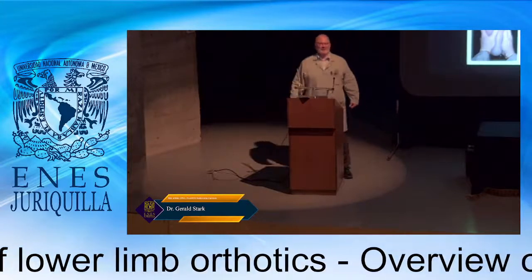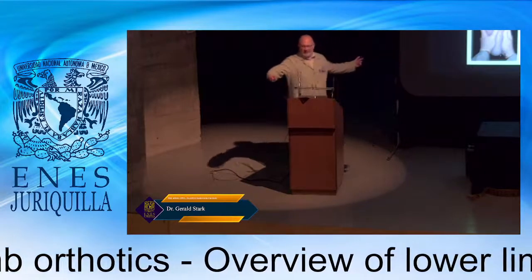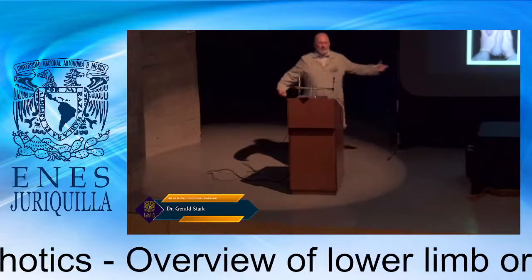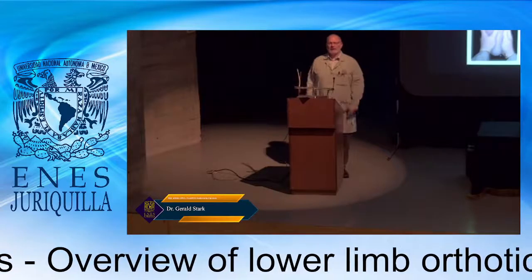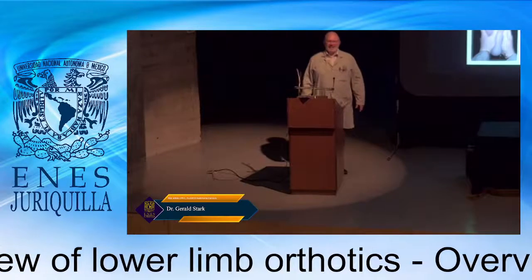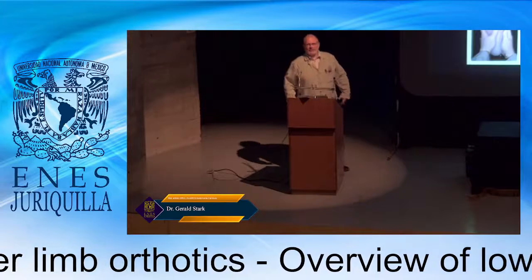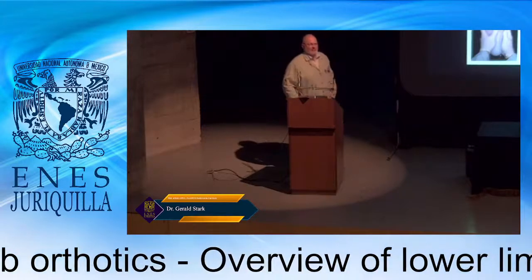The patients wanted to be upright, even if they could only walk within a 15-meter area. One of the adult patients we had was a lawyer, about 6'4". He liked standing and addressing the jury, and he was able to do that with the RGO. But there is a certain walk that you have to use.